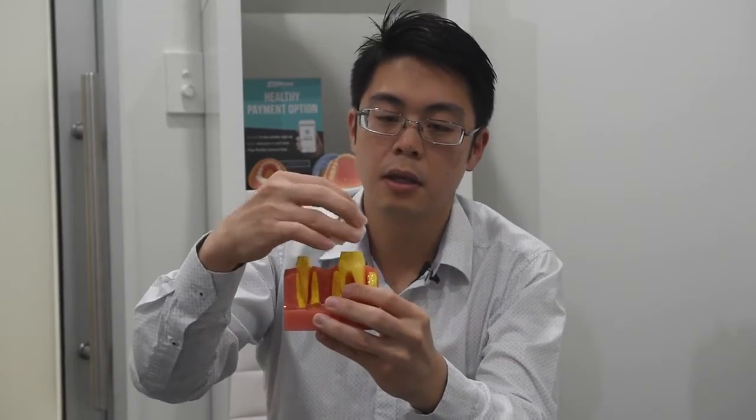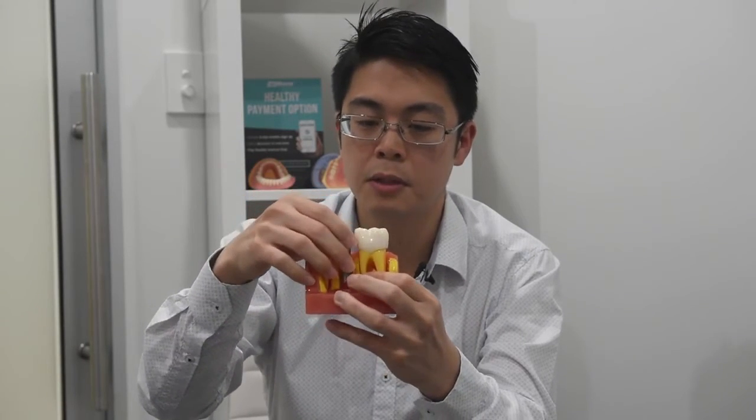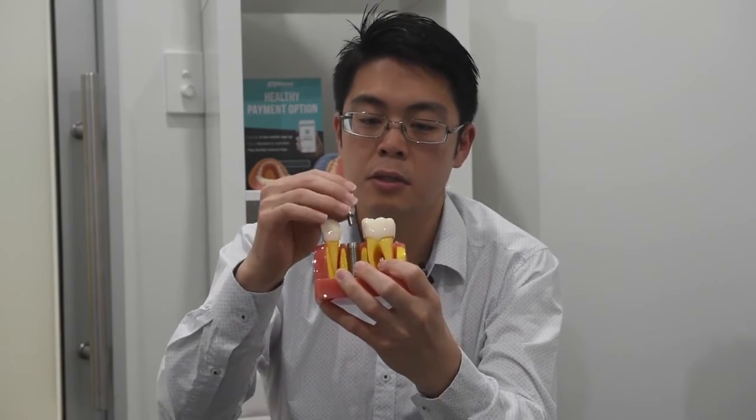So that's why, instead of doing these, we consider the implant, where the implant is a tooth by itself, an option where we restore the missing tooth by itself, where we don't affect the other 2 teeth next to it, and it is not an option where it comes in and out. So once we put the tooth in, it stays in, and it functions as a normal tooth.